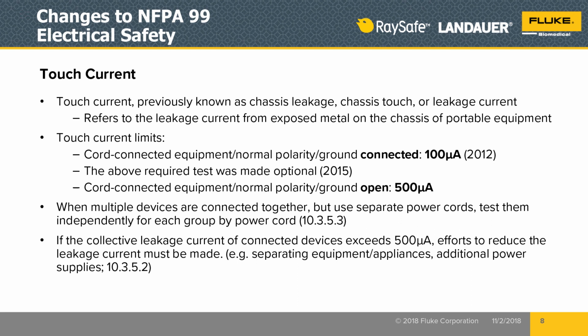It's important to note that it's dealing with all exposed metal. And that's good to highlight, because in the testing, even if the metal is normally connected to ground and earthed, part of this testing has that ground lifted. So it's still important to test all the metal to make sure that if there was a fault or a hazard, the person using the equipment or the patient couldn't get shocked from it.